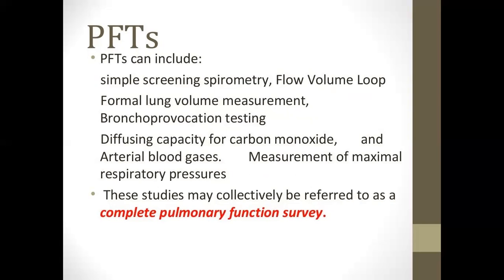PFTs can include simple screening, spirometry, flow volume loop, formal lung volume measurement, bronchoprovocation testing, diffusing capacity for carbon monoxide and arterial blood gases, measurement of maximal respiratory pressures. These studies may collectively be referred to as a complete pulmonary function survey.